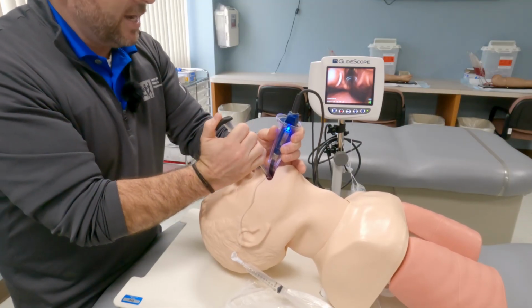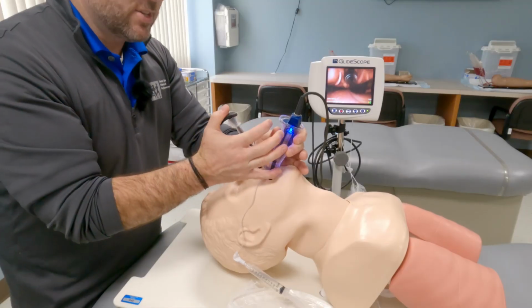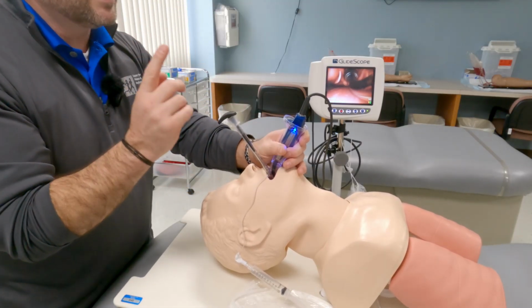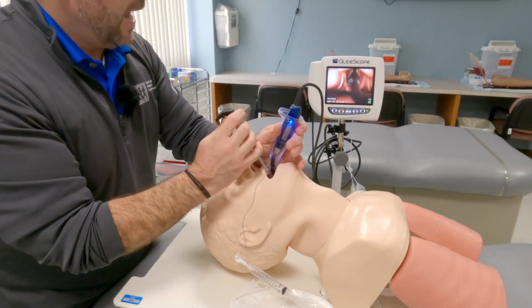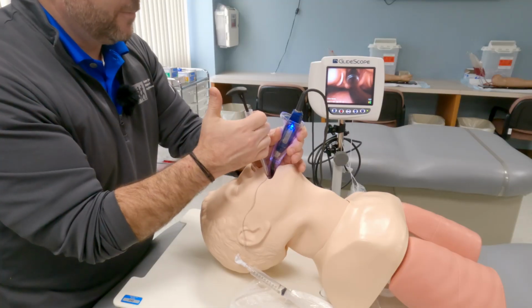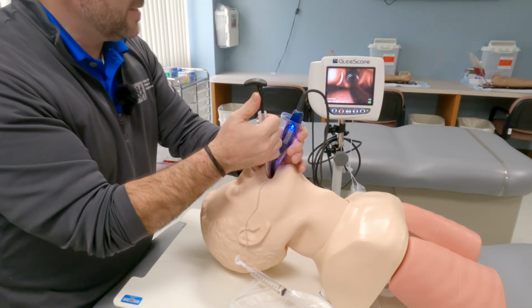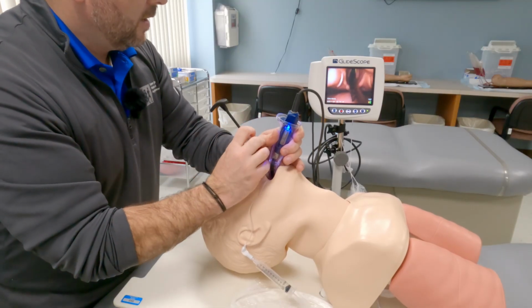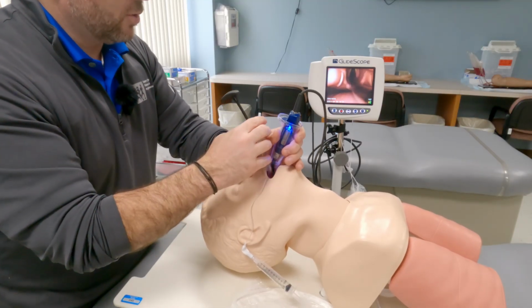But I get to this point right here, and I keep pushing, and it actually meets a lot of resistance. I have a lot of resistance right here. This is the key to using this. At this point, you have to pop this up. So you're going to have it down, you're going to pop it up like this, and you're going to kind of insert the tube this way. Okay, tube is past the cords.